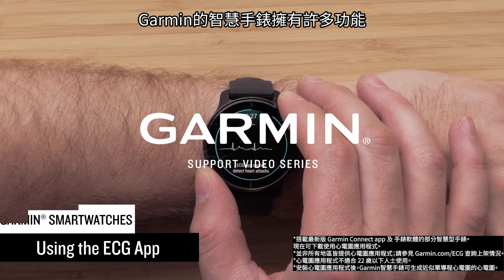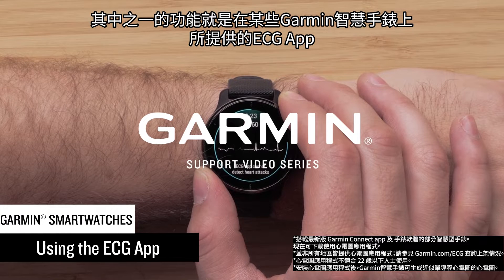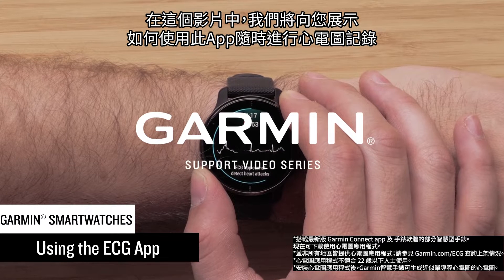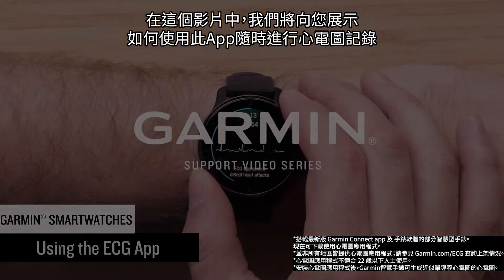Garmin smartwatches have many features that can help you better understand your body. One of those features is the ECG app, available on select Garmin smartwatches. In this video, we'll show you how to use the app to take an ECG recording anytime you like.